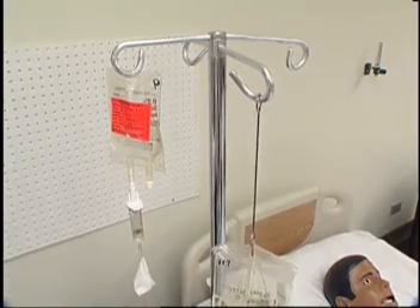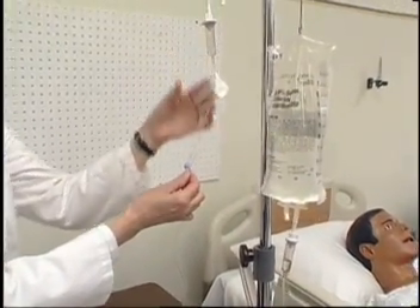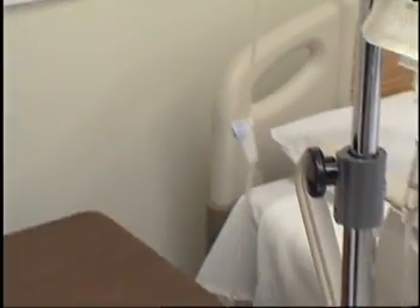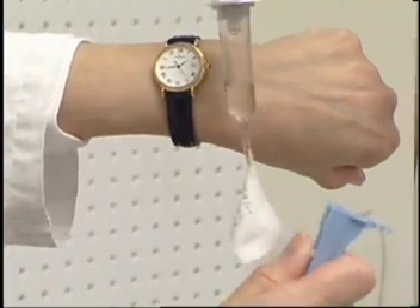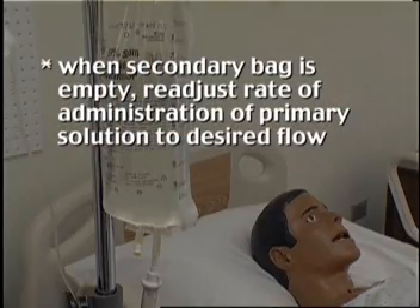If an infusion pump is not available, use the following procedure: Set the flow rate for the secondary piggyback medication by completely opening the clamp on the secondary tubing, then regulating the drops per minute using the control clamp on the primary tubing. When the secondary bag is empty, readjust the rate of administration of the primary solution to the desired flow.